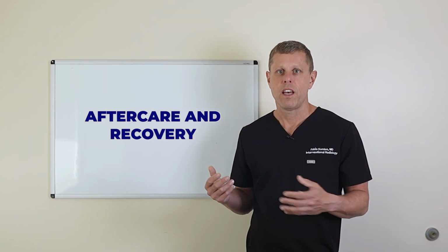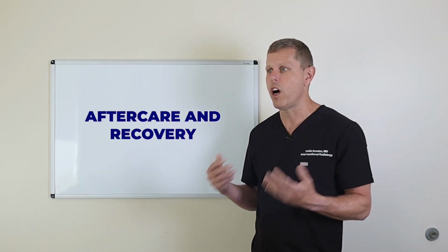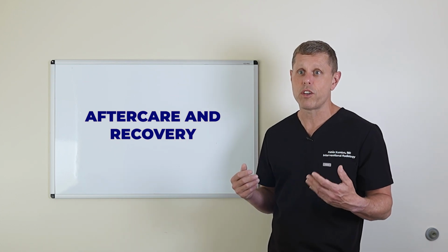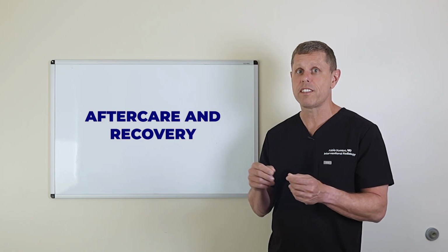As far as the central lines, they obviously need to be flushed regularly, and your doctor or your nurse will advise you how often it needs to be done. But of course, if you're using the line every day, you want to make sure that after you use it, you flush it really well so it doesn't have any blood clots inside it.